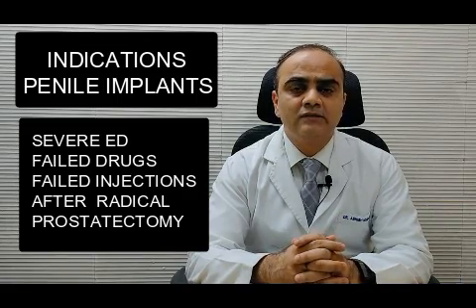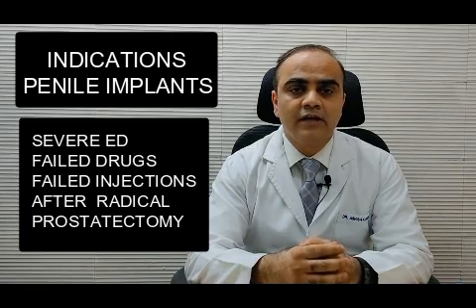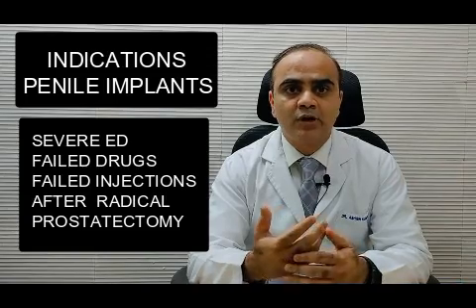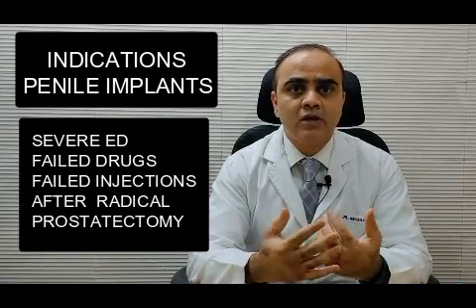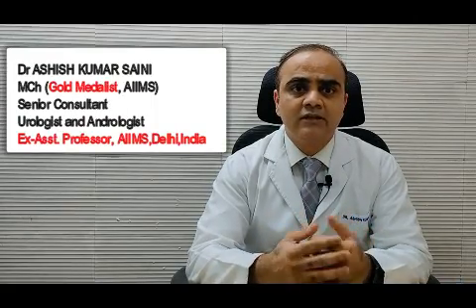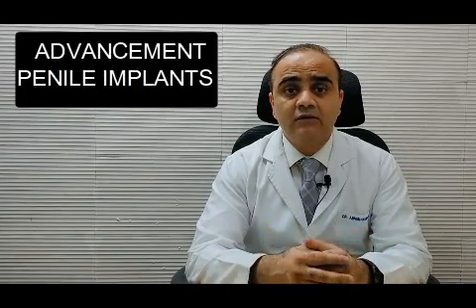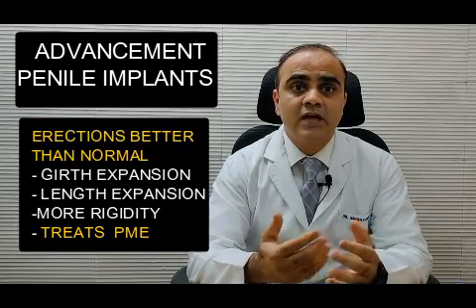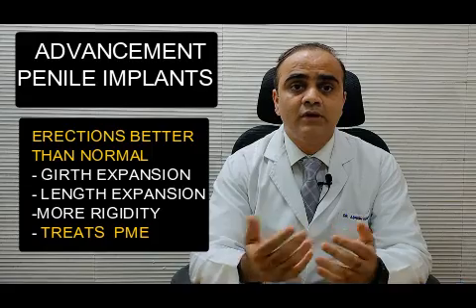A penile implant is placed in a patient who has severe ED, where the erections are not there even despite first giving the drugs and then putting them on injections, intracavernosal injections, doing PRPs, doing shockwave therapy. And when we have exhausted all our methods in those patients, we have to offer them a penile implant. But luckily, the penile implants have improved by leaps and bounds, and now the penile implants can actually give you an erection which may be similar or better than a normal erection.